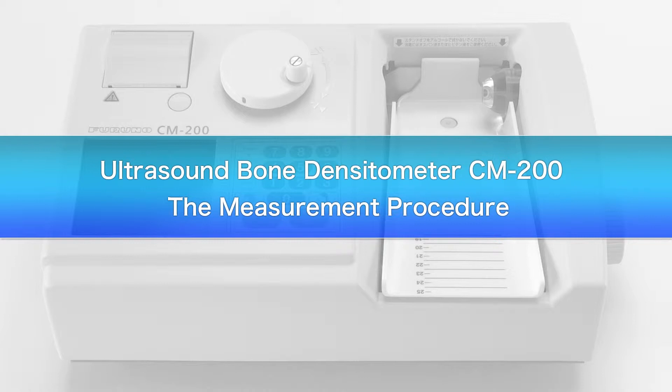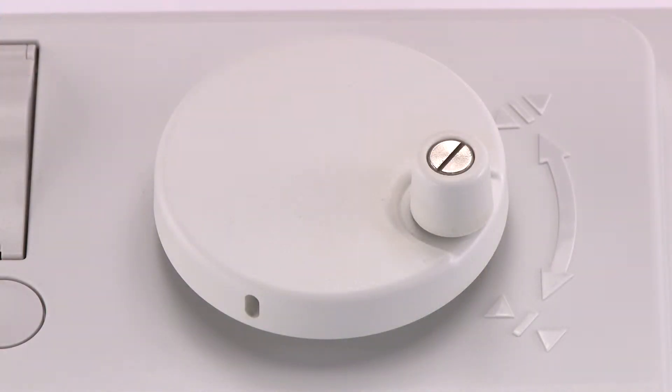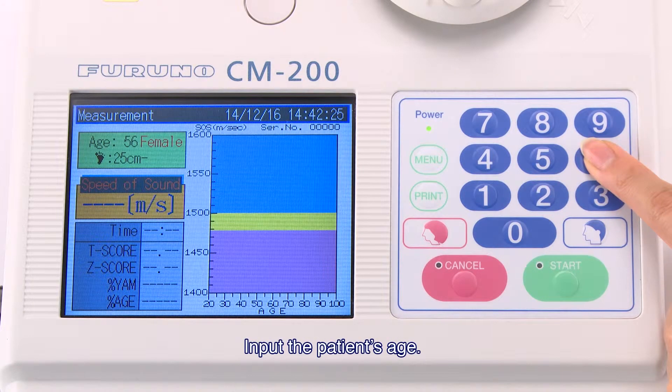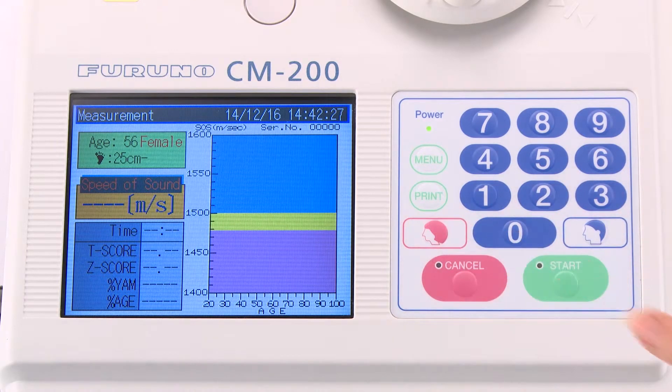We will now explain the measurement procedure with the CM200, produced by Huruno Electric Company. First, input the patient's age. Select the patient's sex by pressing the male or female key. This completes the pre-measurement data input.